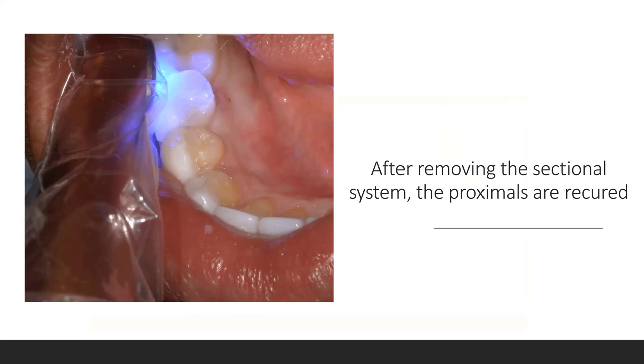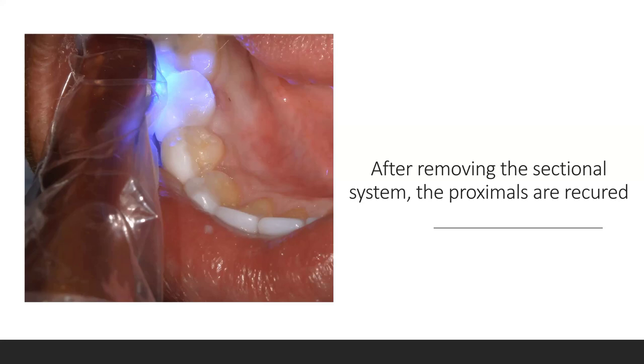Whenever I take off my sectional matrix band, I want to do a post-cure proximally — 10 seconds on the buccal, 10 seconds on the lingual. You're never going to hurt that resin by over-curing it. I want to make sure every angle is covered to maximize my curing.